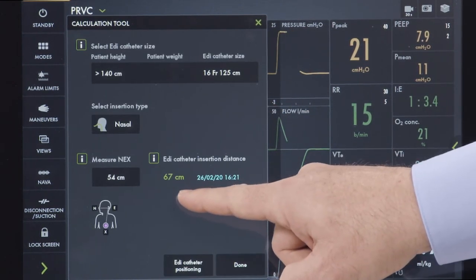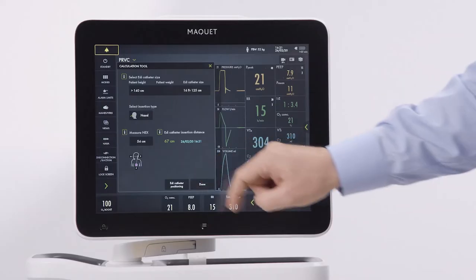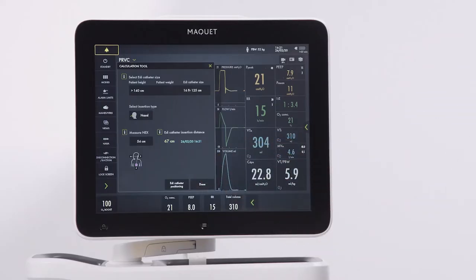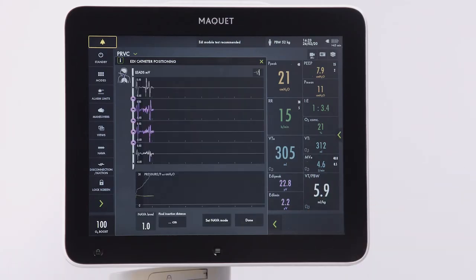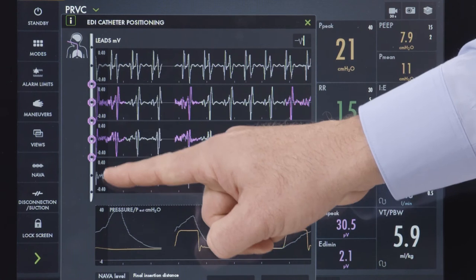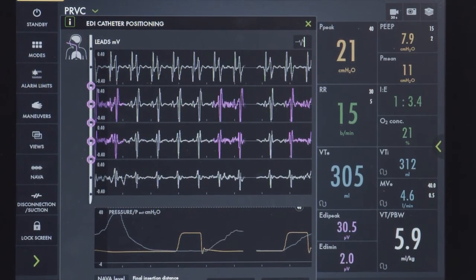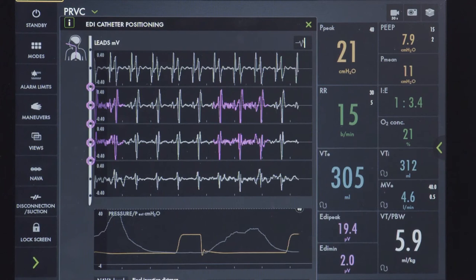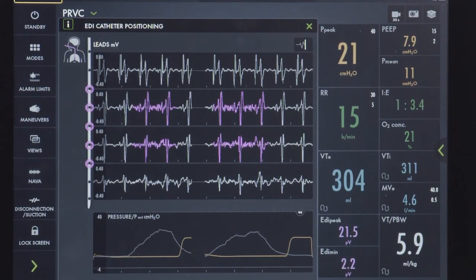This is important: always follow hospital routines to check the positioning of the EDI catheter when it is used as a gastric feeding tube. Continuing the workflow, press on EDI catheter positioning. Verify the position by analyzing the ECG waveform. Both the symbols on the representation of the EDI catheter and the color highlights on the leads show where the EDI signal is strongest.